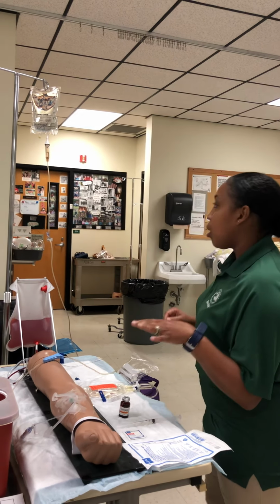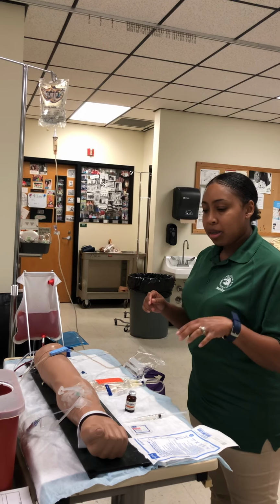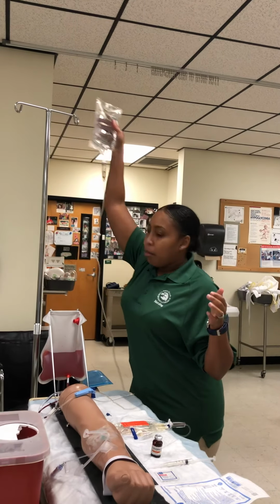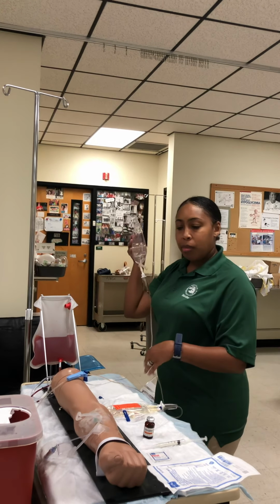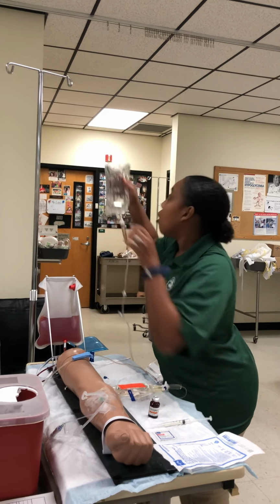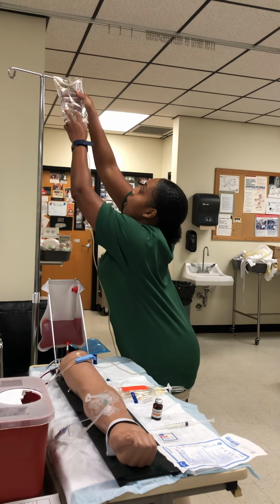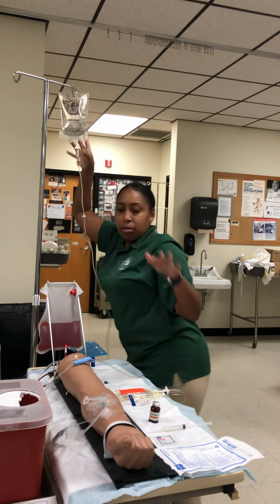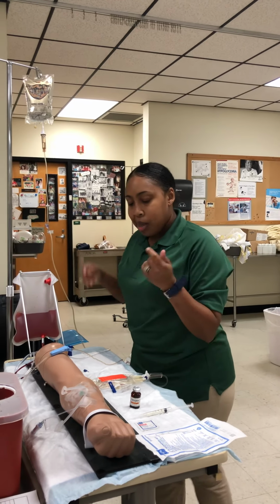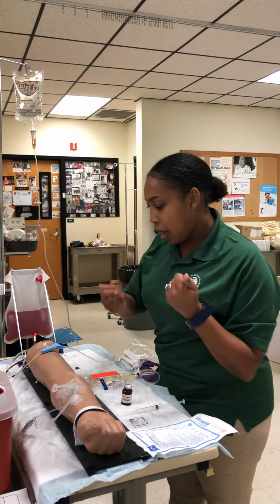Okay. Now what I'm gonna do is check the patency of your IV, and I'm just gonna simply lower your primary fluids to the level of your arm. I'll be looking for any blood return just to make sure that your IV is open and patent. And we did have some blood return because we already have these primary fluids infusing. Now I'm gonna wash my hands.